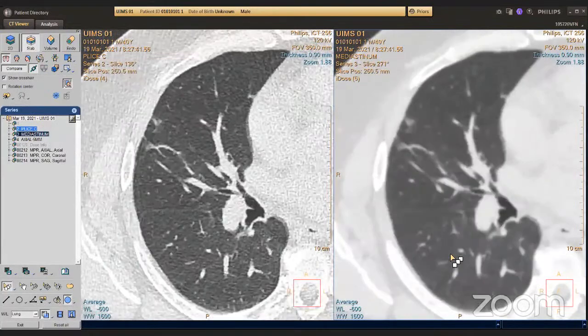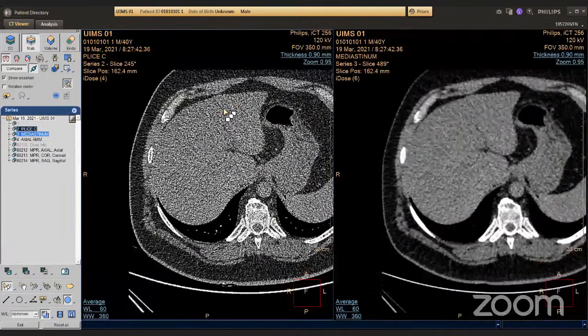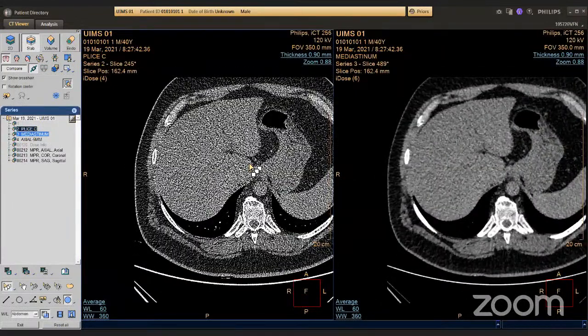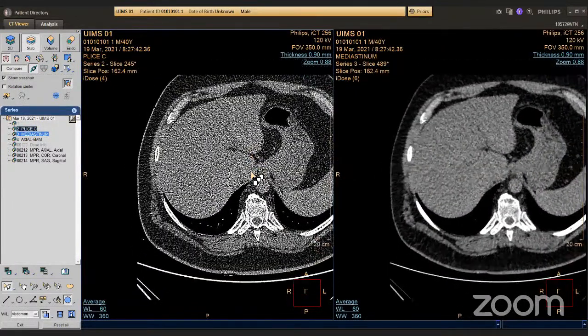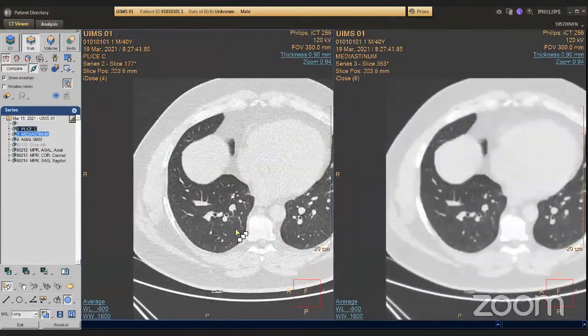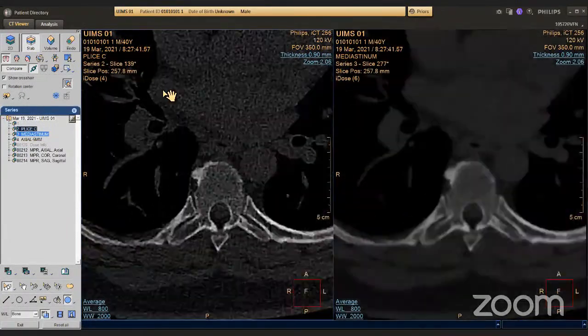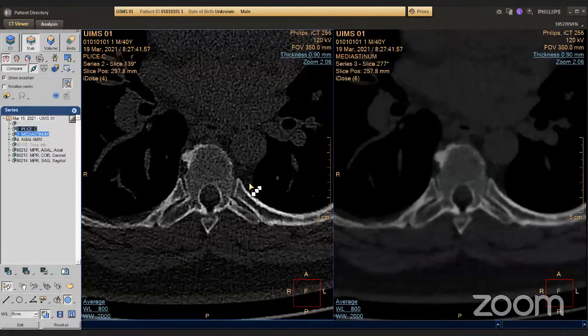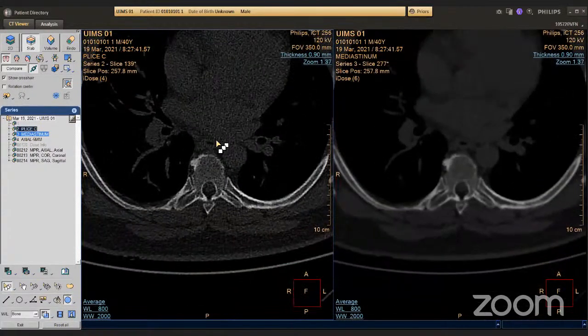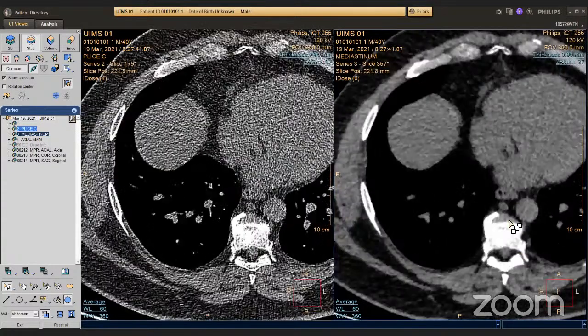And it's important to know that, because if you find yourself looking at a CT with pictures like that and can't imagine what you're looking at, you've probably chosen the wrong data series, and you need to change that or look in different windows. The sharp imaging is great for lungs and for bones. You can see the bones are also better here. So that's for the parts where you have big density changes. And soft is for soft tissues, which is actually much better.